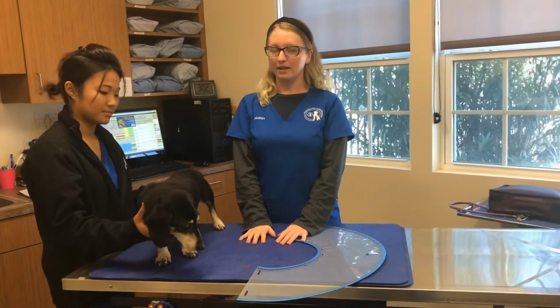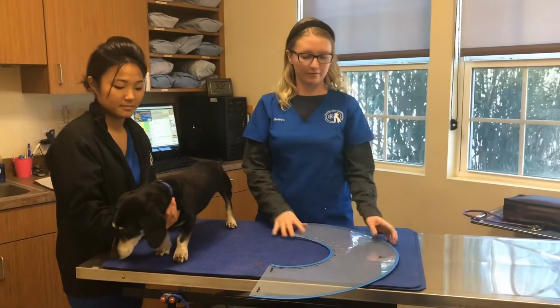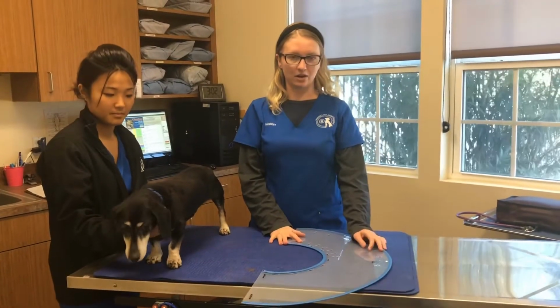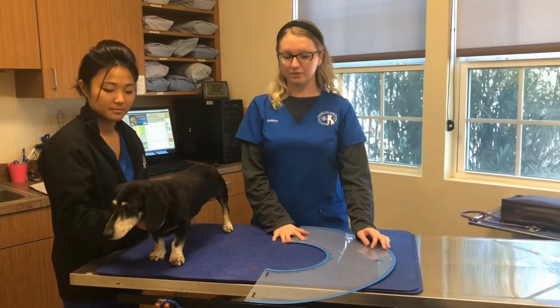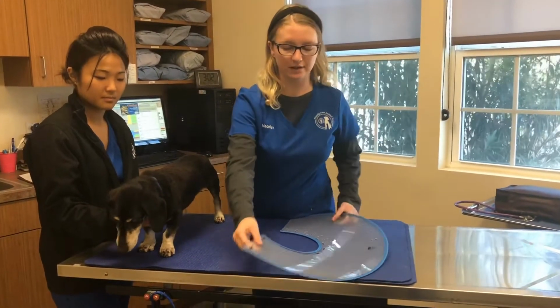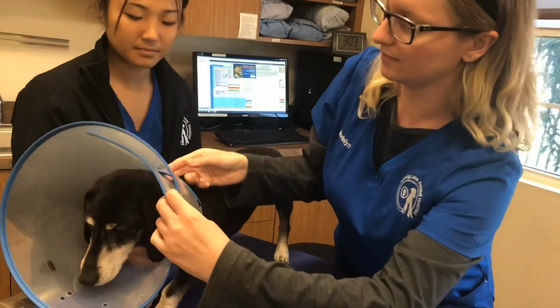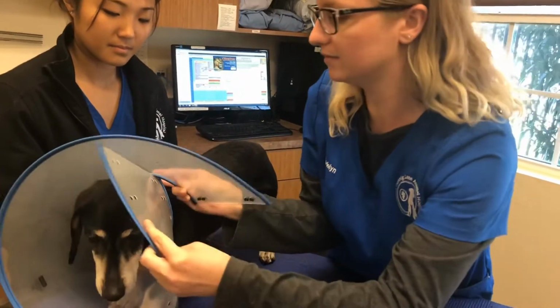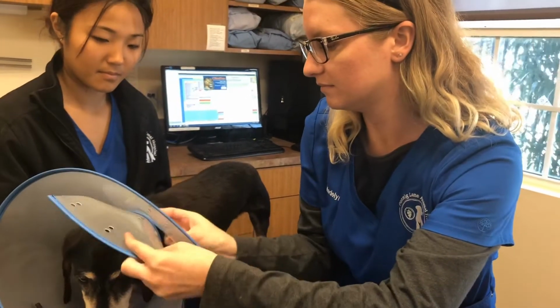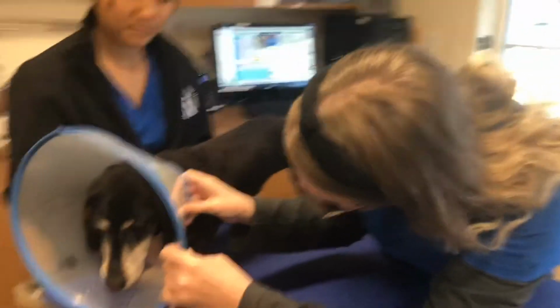Okay, now we'll be applying an e-collar to a canine patient. This is Buster. I've selected a 20 centimeter e-collar for him. So to apply this type of e-collar, you can just wrap it around their neck and adjust it from there. So I'll wrap around this way, pull it together, and then clamp it closed.